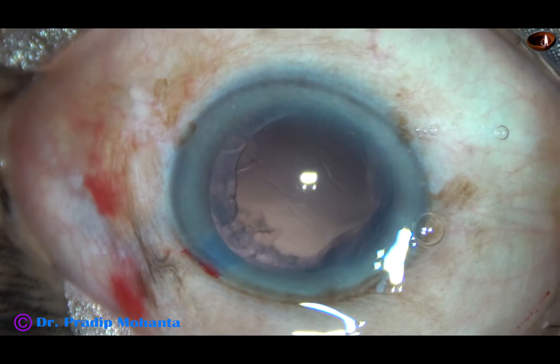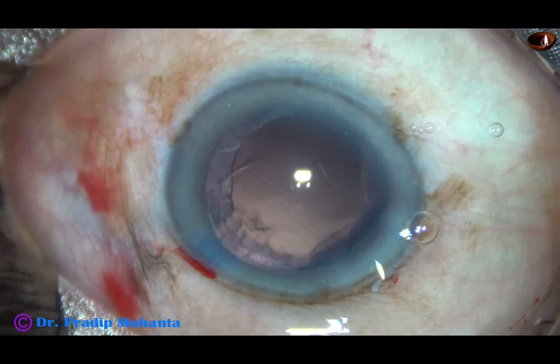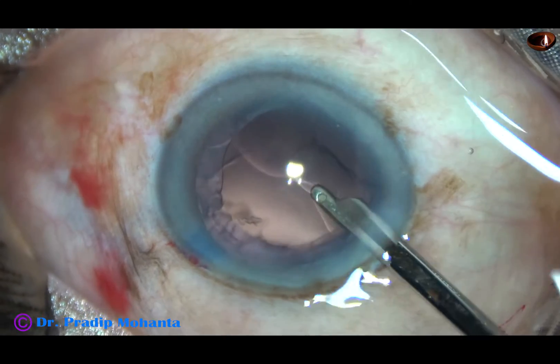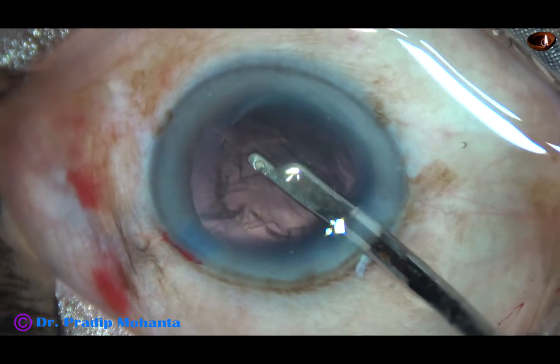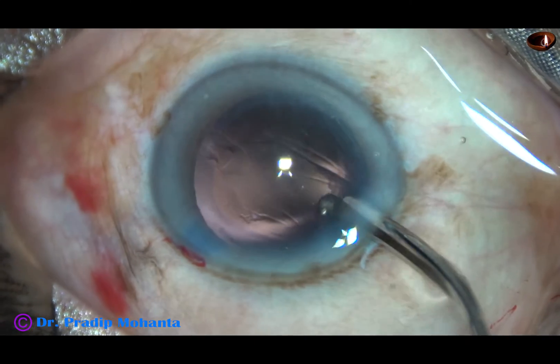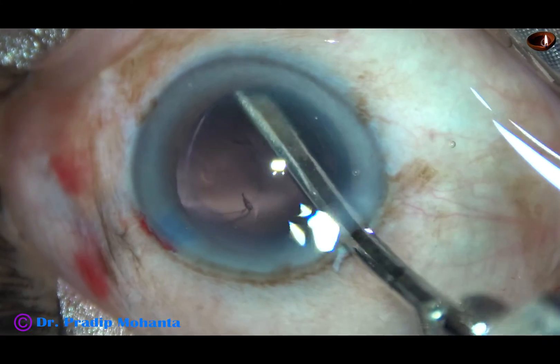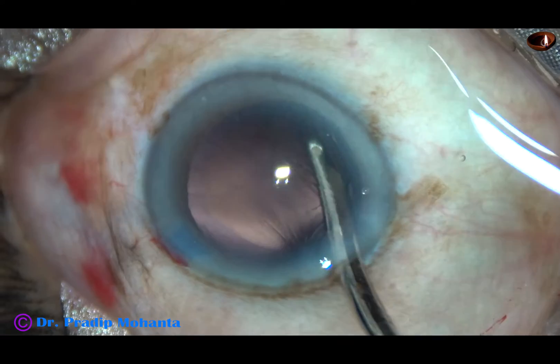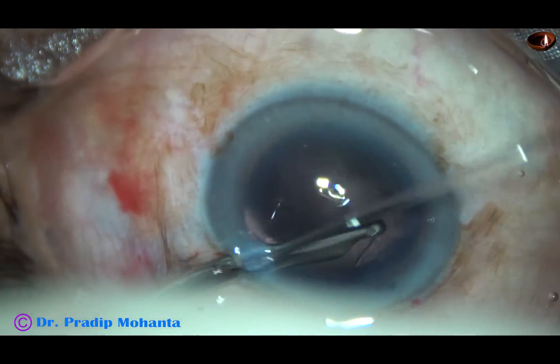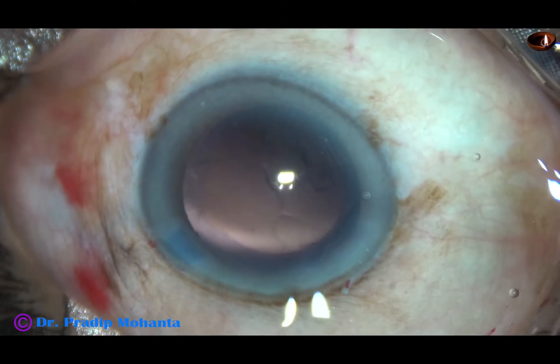Now I have to remove the cortical lens matter. I am going to use a 23G Simcoe cannula to remove the cortical lens matter. I have made only one side port and I am not going to use bimanual irrigation-aspiration because I don't have another side port. The side port is a little wider but it is only one side port, and it is 90 degrees away from the main incision. This means the astigmatism induced by the main incision is neutralized to some extent by the wide side port.